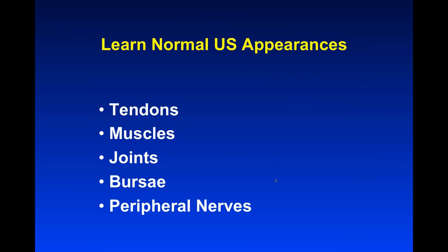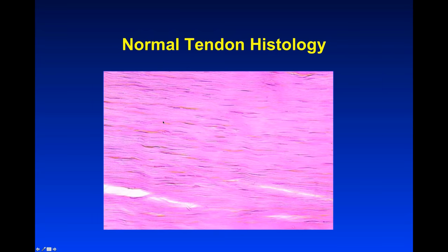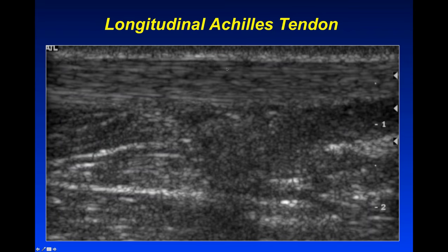One benefit of MSK ultrasound is that each type of tissue has its own signature appearance. Starting with tendons: normal tendons have nice parallel collagen fibers, very monotonous. When the ultrasound beam hits these fibers, it produces echoes. Looking at this longitudinal Achilles tendon, we see alternating hyper- and hypoechoic lines — bright and dark lines going across the tendon. That is the signature of tendons no matter where we are in the body.